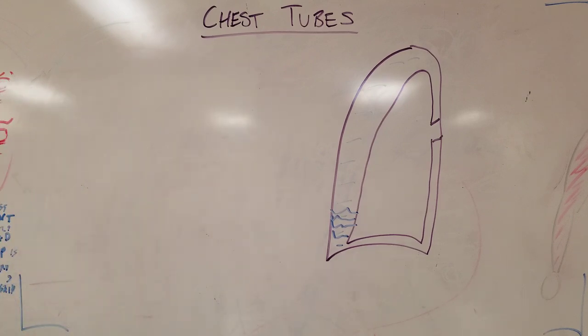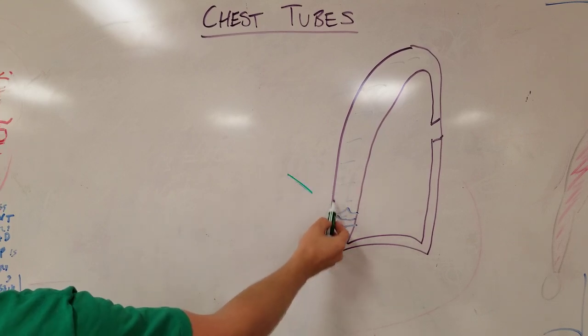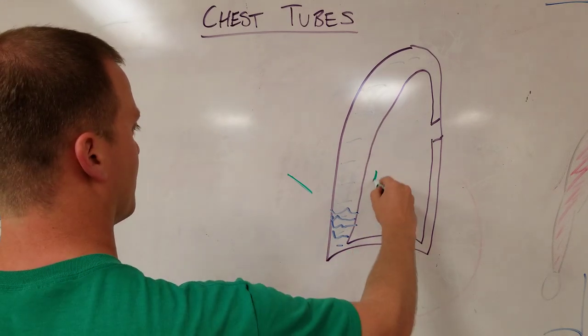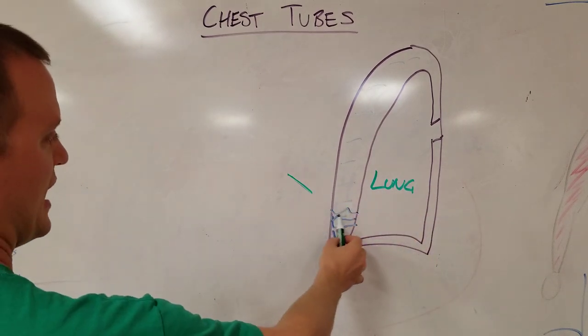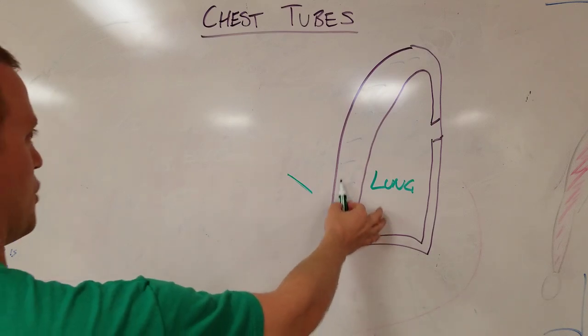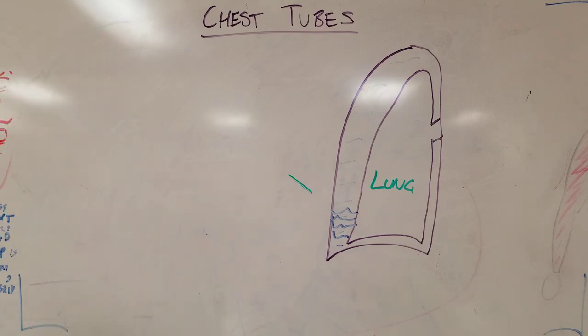Your chest tube. What we're gonna do is make an incision on the chest. The chest wall will be here. This purple line denotes the pleural cavity, or the parietal pleura, the outside lining of the chest wall. Here you can see the lung, and the lung has fallen away. This would be like a hemothorax, a fluid collection with blunting of the costophrenic angle on this side. This would be a pneumothorax with air up here. This would be a mixed level hydropneumothorax or something like that. This is commonly seen in trauma.